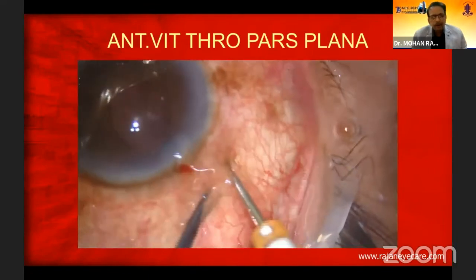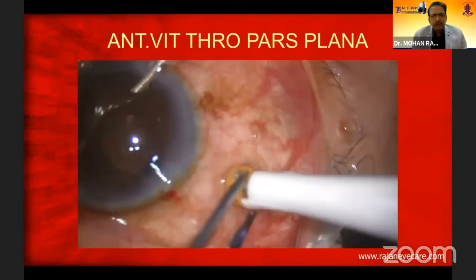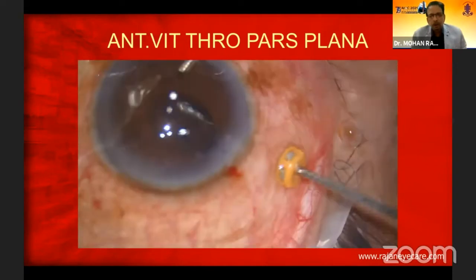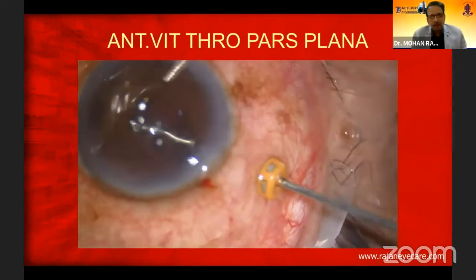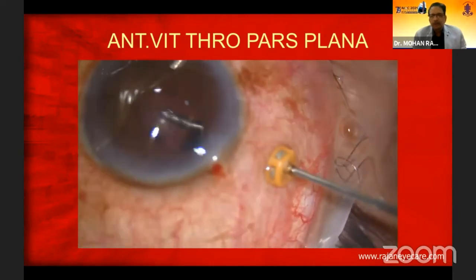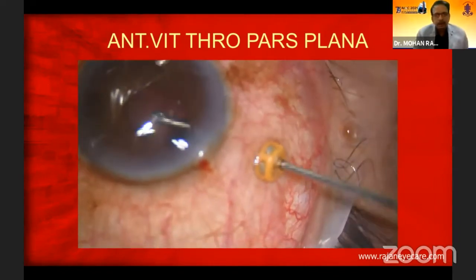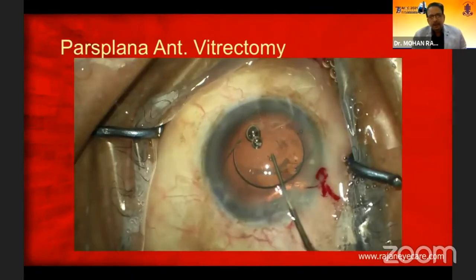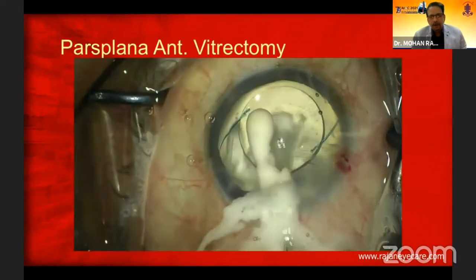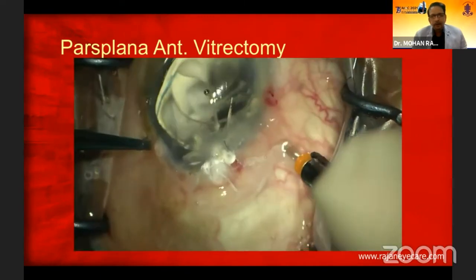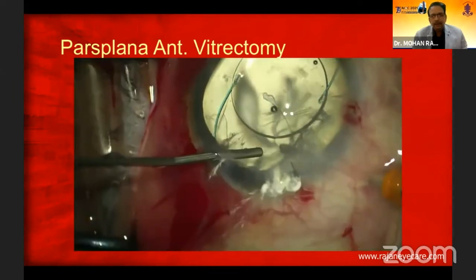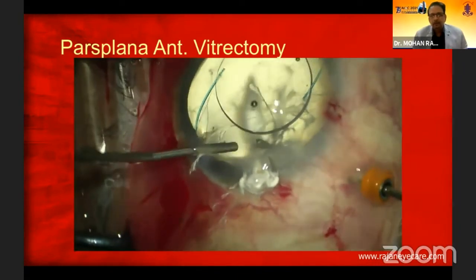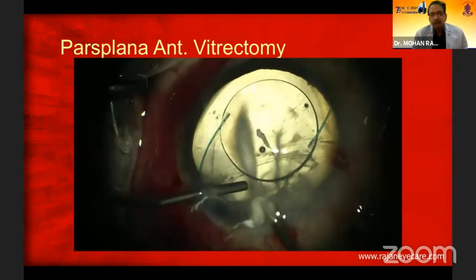Once I put a trocar and cannula, you can see how beautifully the vitreous in the anterior chamber comes off. That is a very, very important message. The trocar and cannula is not very difficult to put — just measure 3.5 mm from the limbus. If you don't have a trocar and cannula, you can always put a sclerotomy with a 20-gauge needle. I'm putting preservative-free triamcinolone diluted there, and putting a trocar and cannula into the vitreous cavity, giving an anterior chamber maintainer, and removing the vitreous from behind.